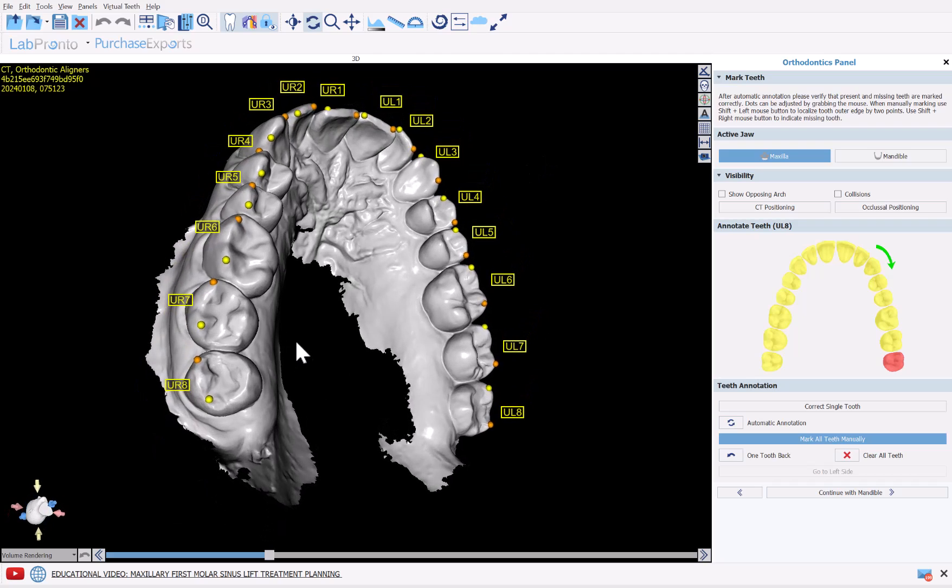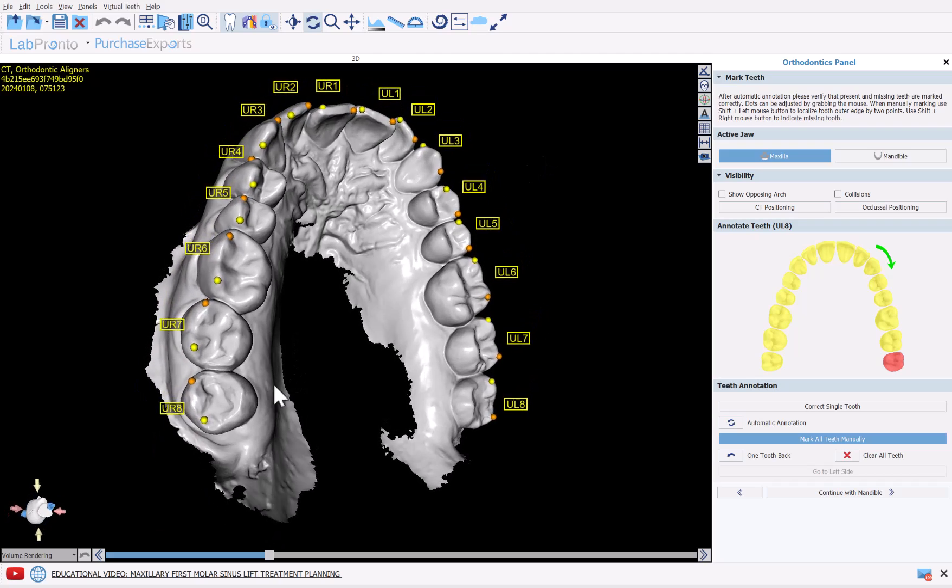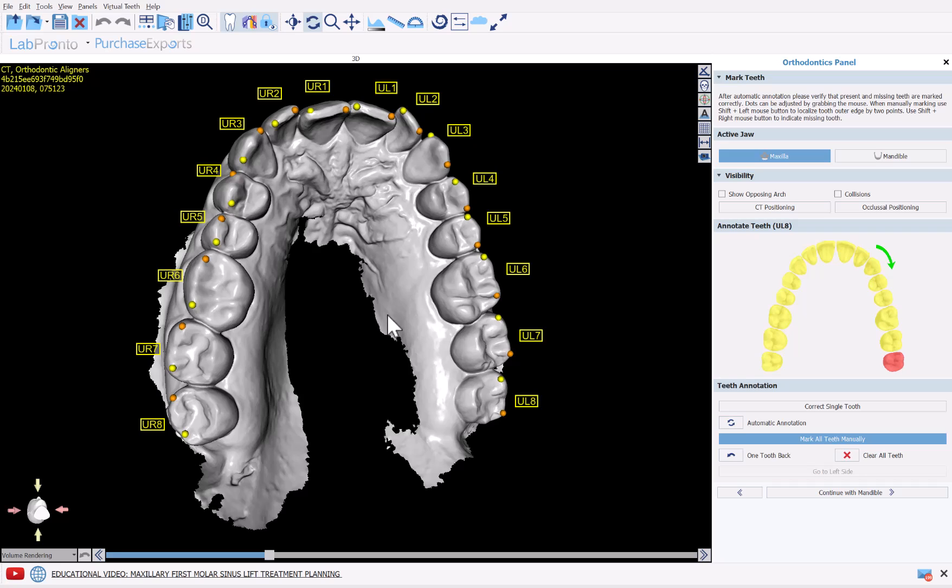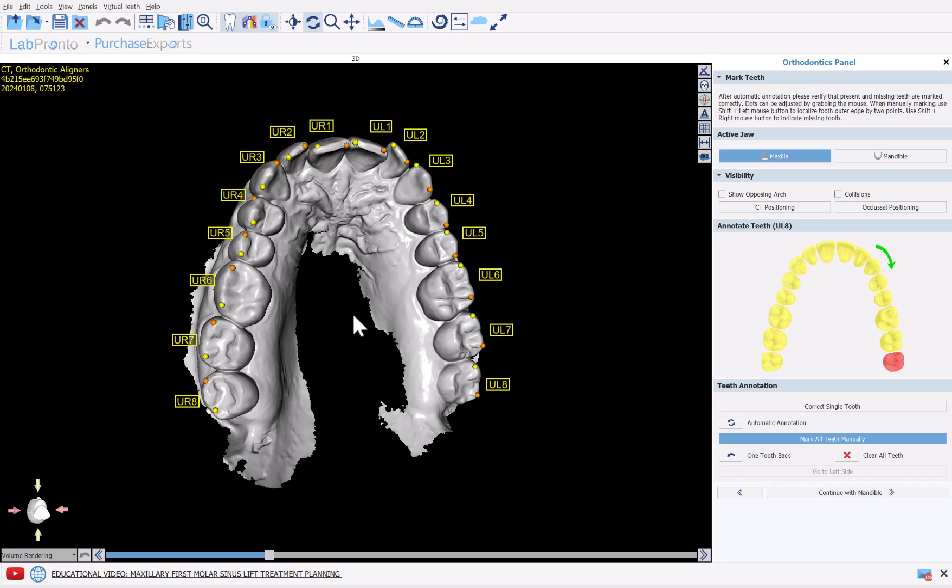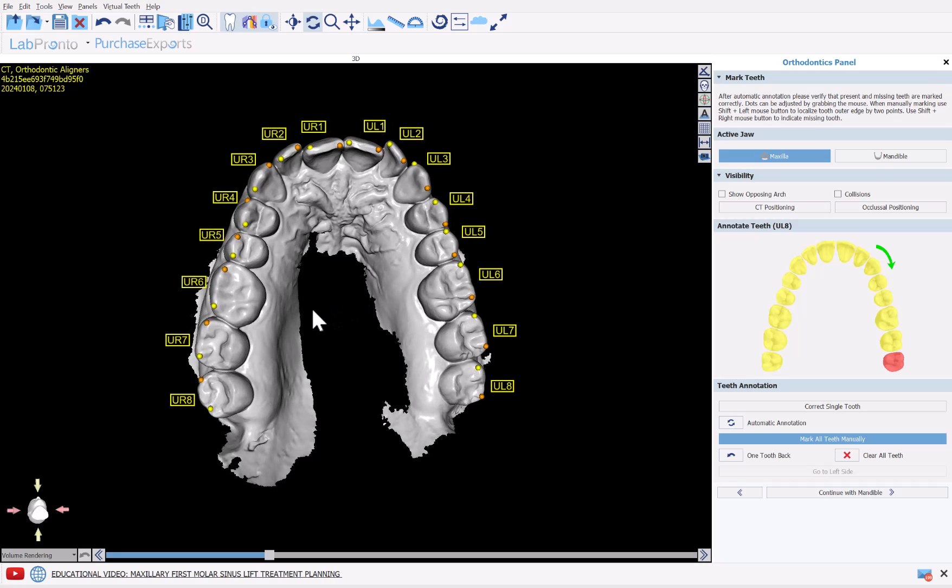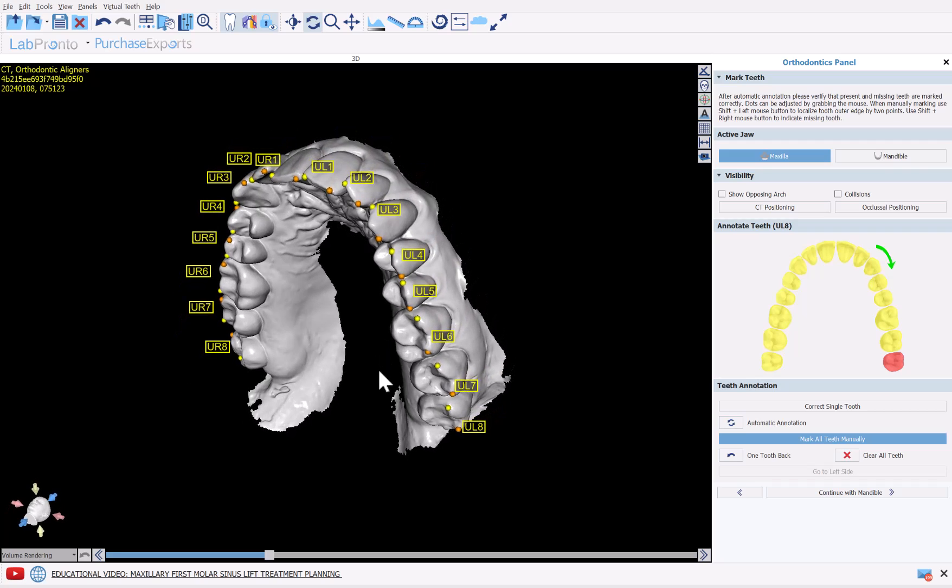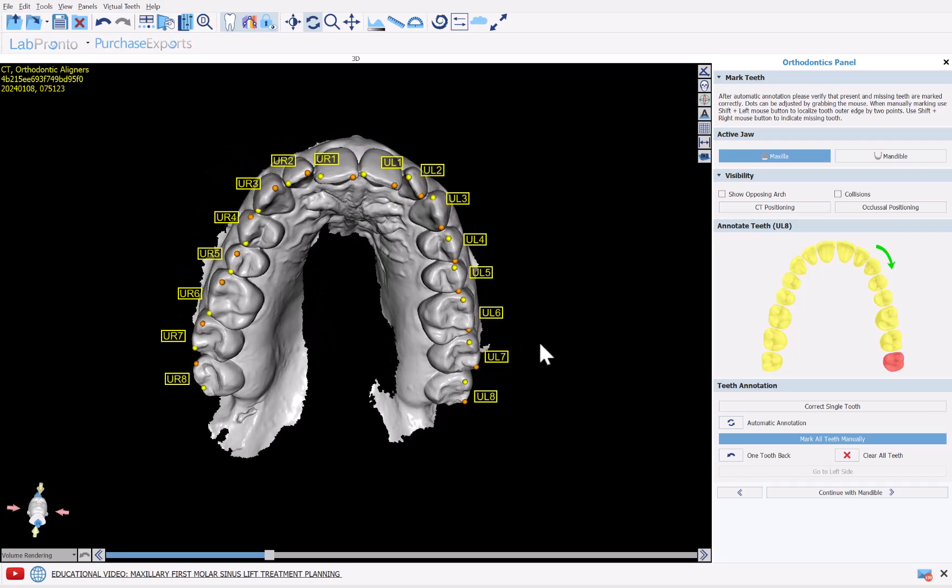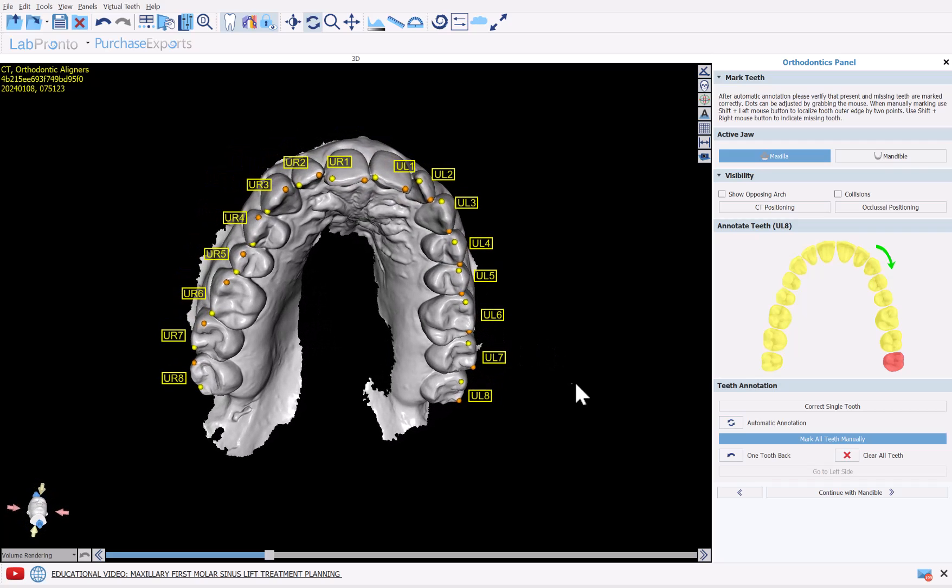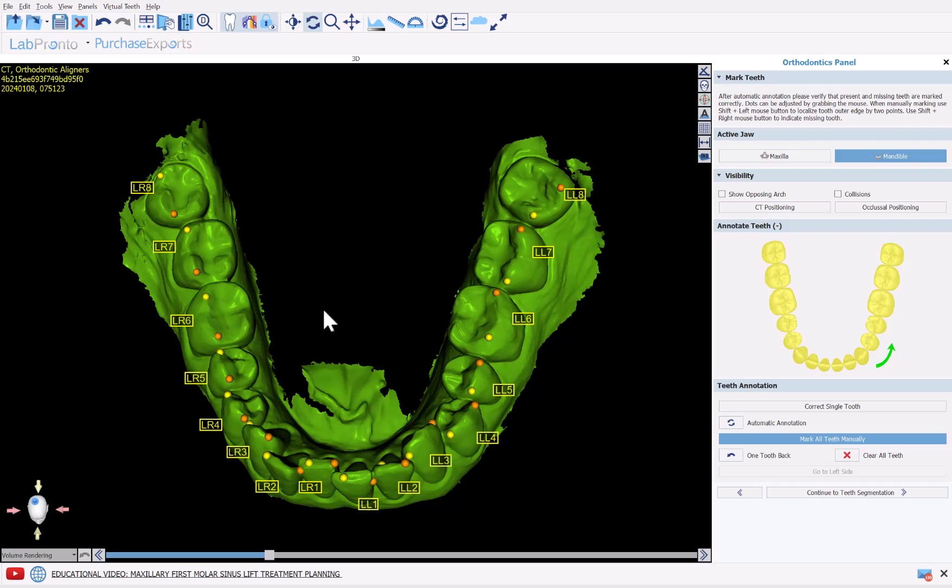We could review the annotation. If we need to fine tune the placement of any of the nodes, simply grab and drag. If for whatever reason we want to annotate completely manually, we have the options here to clear all teeth and then you can hold down the shift key and left click going around the arch to place the dots. Otherwise, if everything looks OK, simply confirm and click Continue with Mandible.